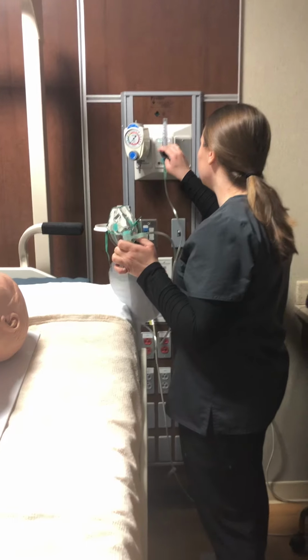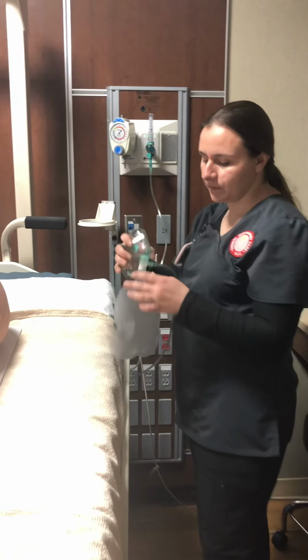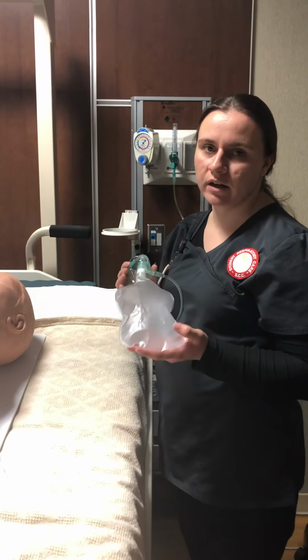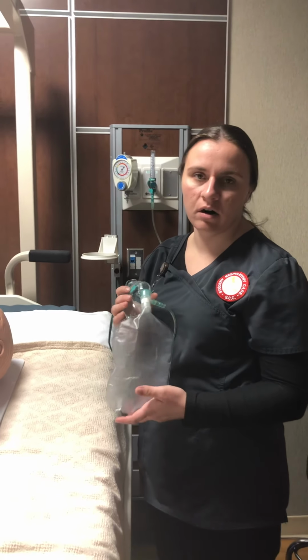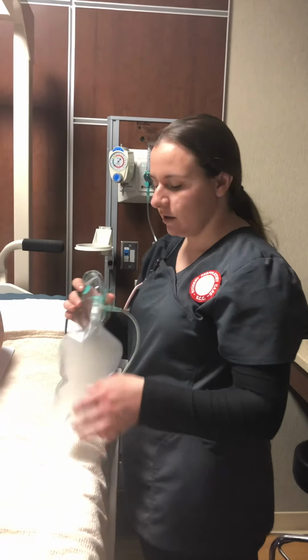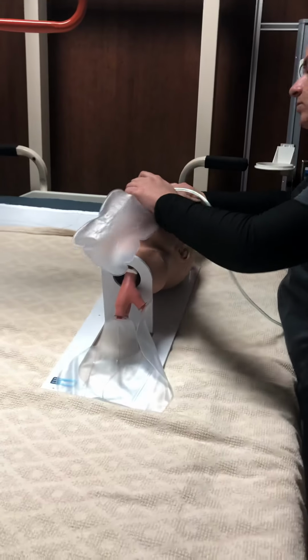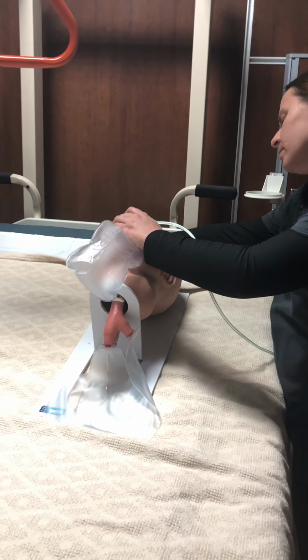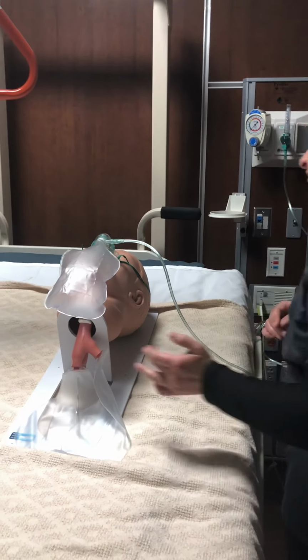With the non-rebreather, you need to make sure that it properly inflates and that the bag stays inflated. You need to watch the patient when they breathe in and out, and if the bag completely collapses, then I need to raise the liter flow up just a little higher. So I'm going to place this on you. This is going to help you get your levels back and hopefully help you feel a little bit better, that way you can get back to normal and get back on your feet.